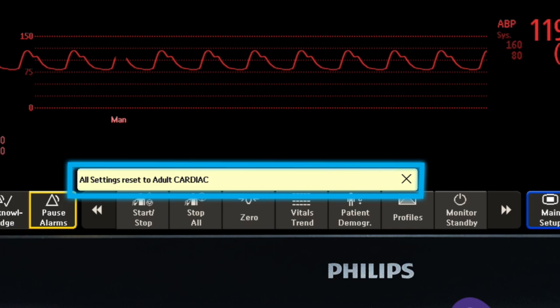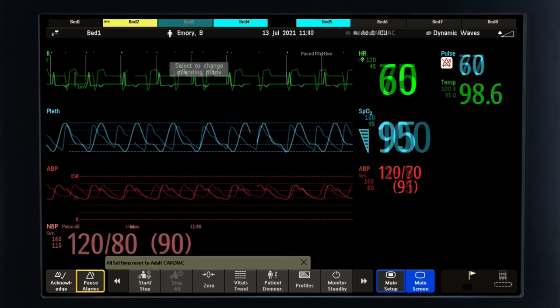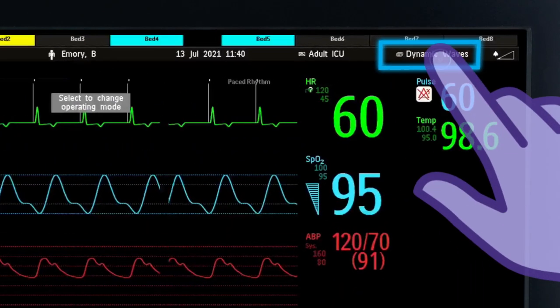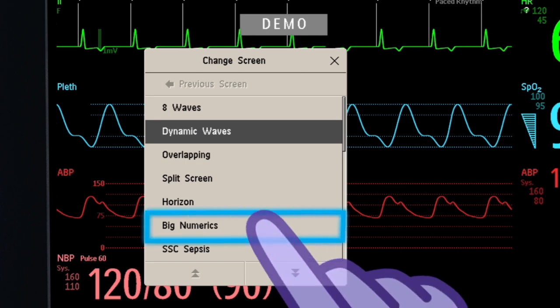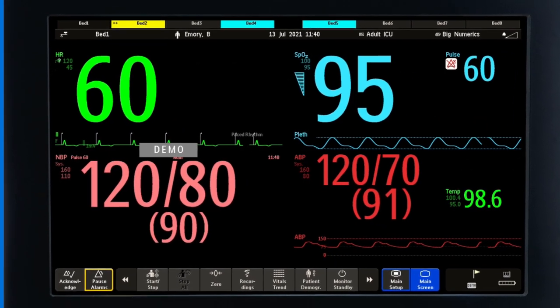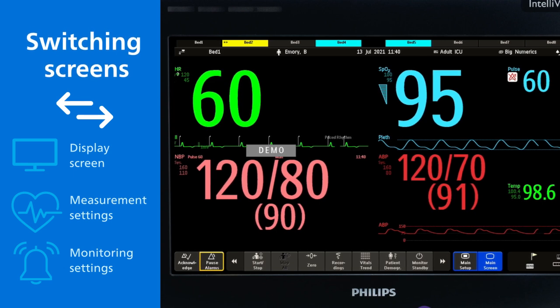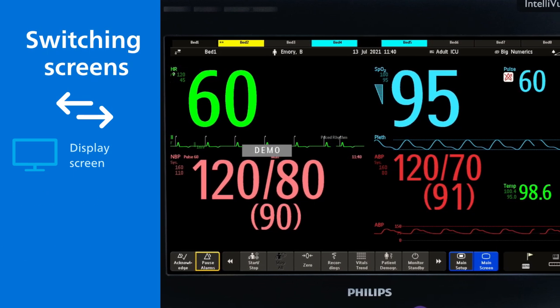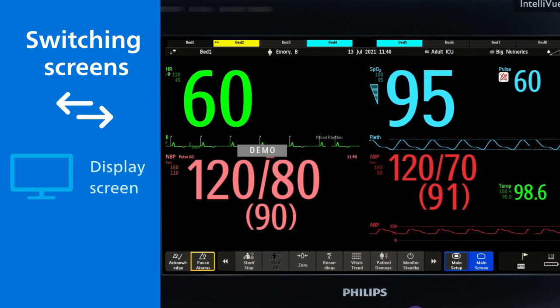Your monitor also has a set of pre-configured screens that are optimised for common monitoring scenarios. You can easily switch between different screens during monitoring. Unlike changing a profile, changing screens does not affect alarms, patient category or other settings. Screen changes only affect what is shown on the display.